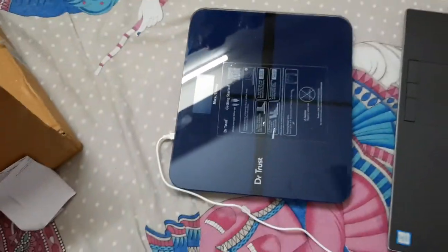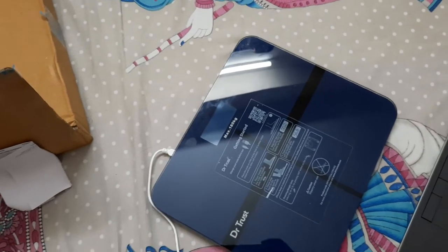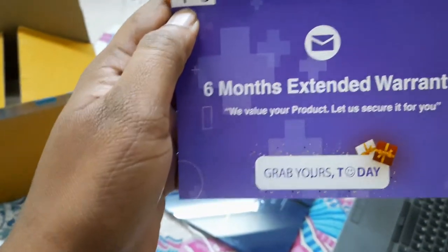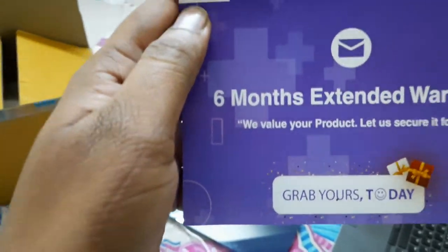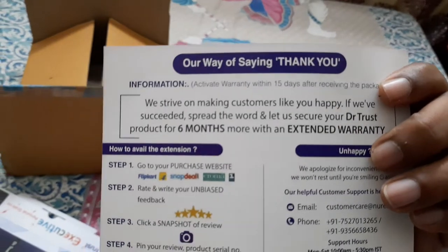There is another variant called Platinum, but I bought the Executive because of the color. The Platinum is a bit gray — like a cement color — and I don't like that. I also got a Dr. Trust six-month extended warranty card included in the box.